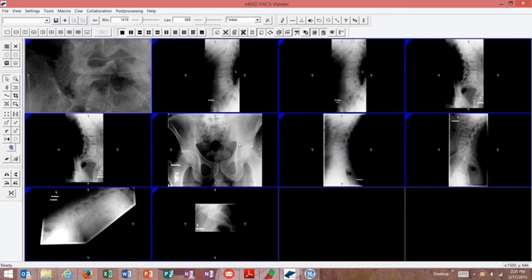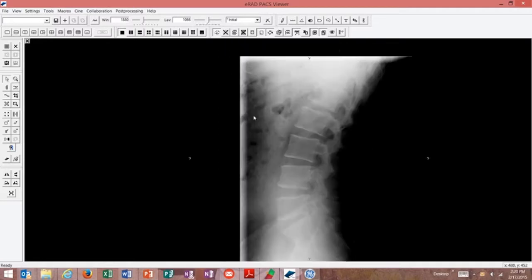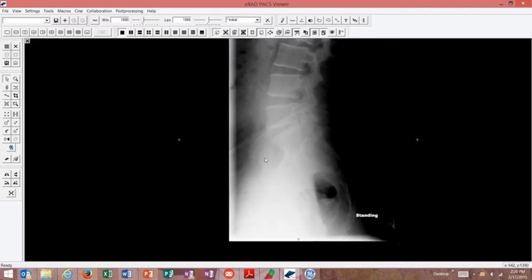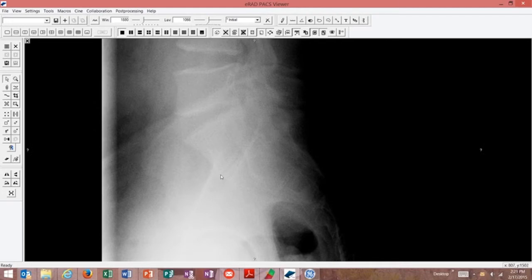Our lateral view is located right here. And I point out the lateral view to show you that it's possible that there may be some form of lumbosacral transitional vertebra here. I don't know about you, but perhaps you might be able to hallucinate a vestigial disc or some sort of segmentation of this S1 vertebra here from the S2 vertebra.